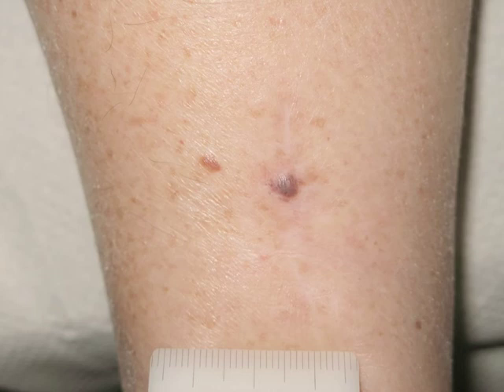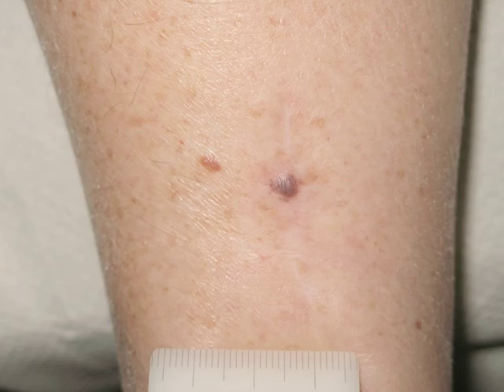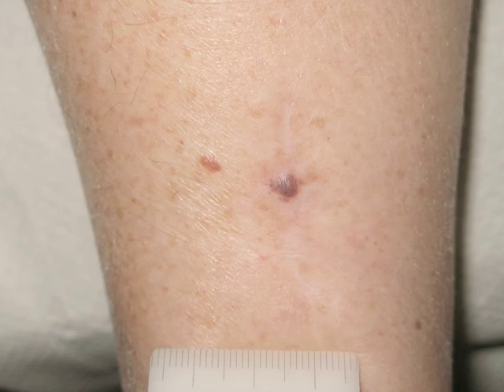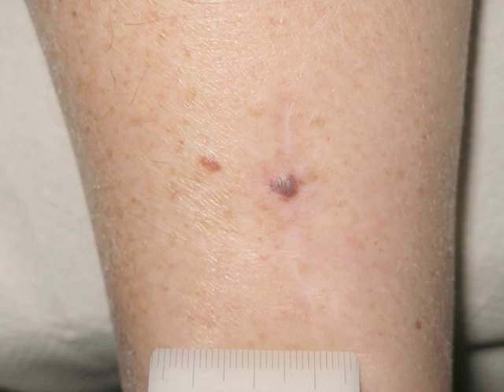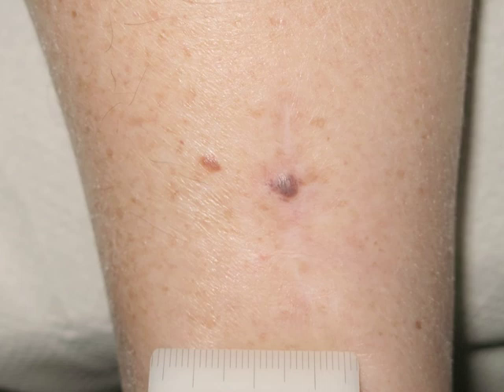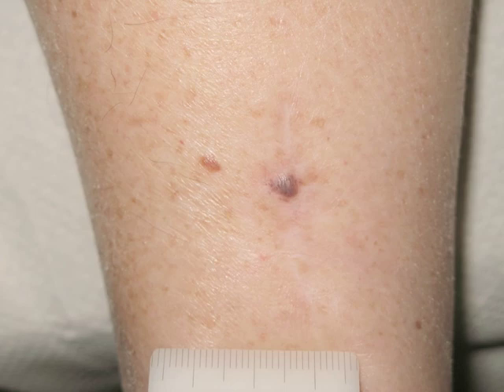This is the leg of a 56-year-old woman presenting with two new papules appearing within and around the scar referring to a previous excision. The original lesion was diagnosed as a melanocytic nevus by a previous pathologist, but the diagnosis was changed into melanoma by the reviewing pathologist. The two new lesions were thus excised and the diagnosis of recurrent melanoma was made with increased confidence.